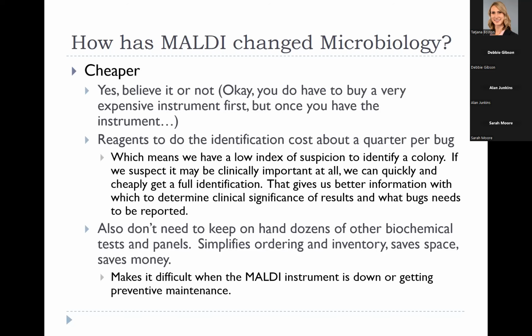I'm worried about Francisella, to be honest with you, because before we got MALDI, we would always have a Francisella or two every single year. We've had MALDI now for going on 8 years, and have never had a case of Francisella in that time. So I'm kind of worried that we may be putting Francisella isolates on the MALDI and getting the wrong identification. So we might be missing some of those.